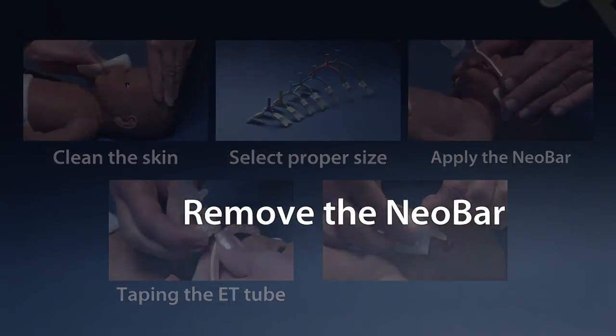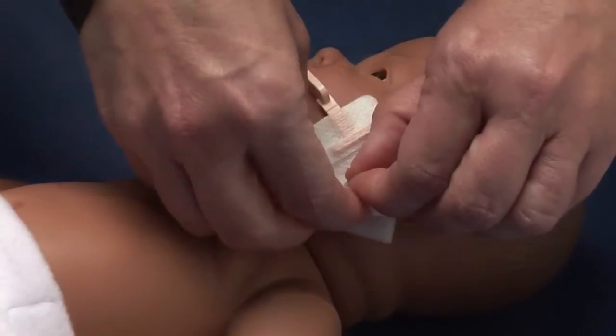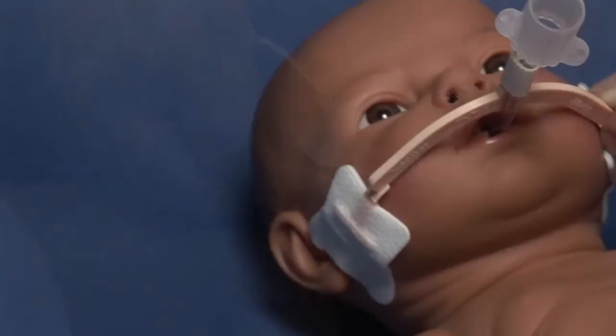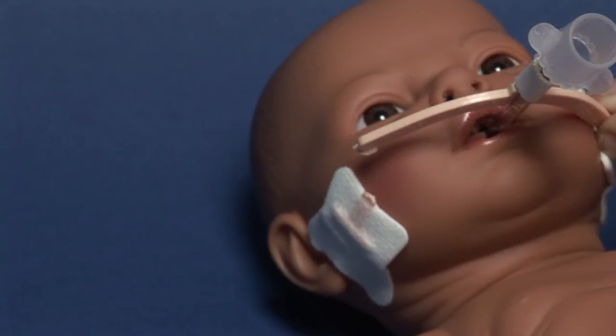Remove the Neobar by saturating the tabs with water or saline, then gently peel back the tabs. In an emergency, simply cut the thin portion at the junction of the bar with blunt end scissors.